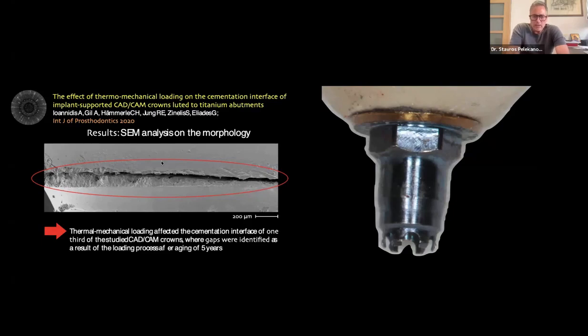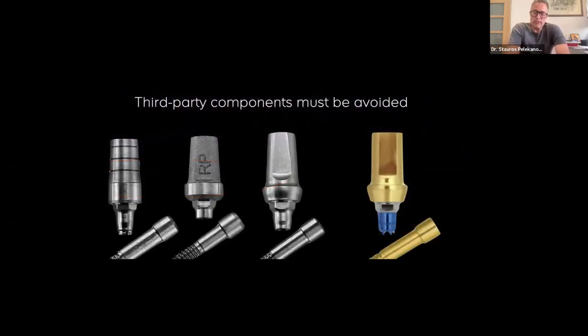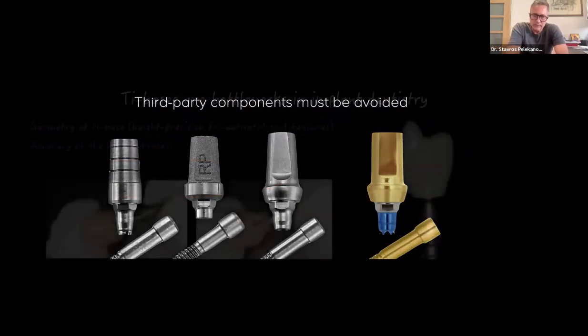So there is always, through thermal and mechanical loading, affection of the cementation gap. And much more if we are using a third-party component, this result is becoming even worse.